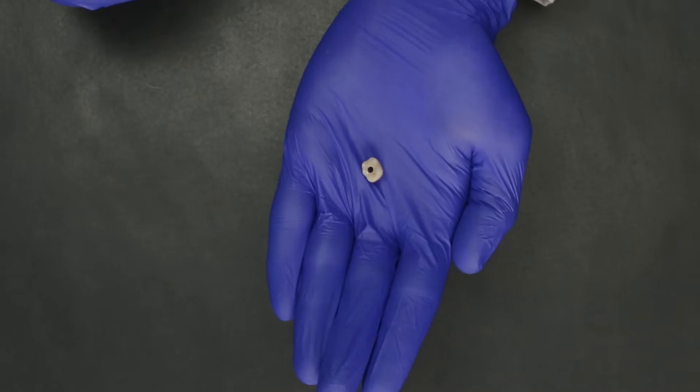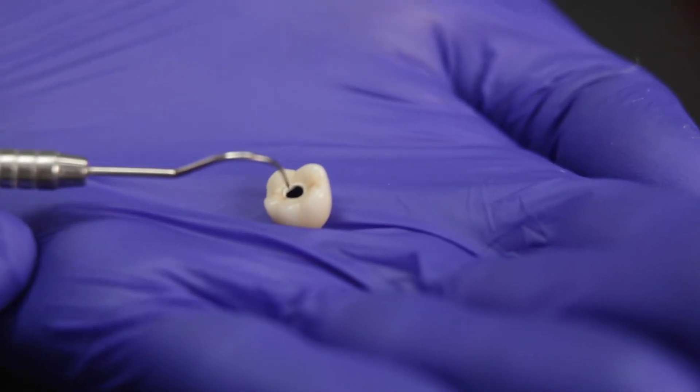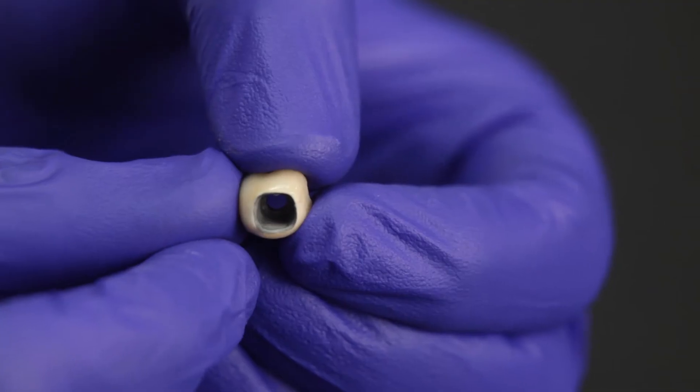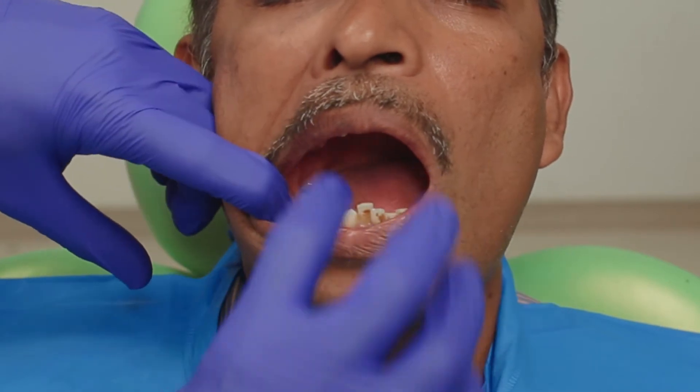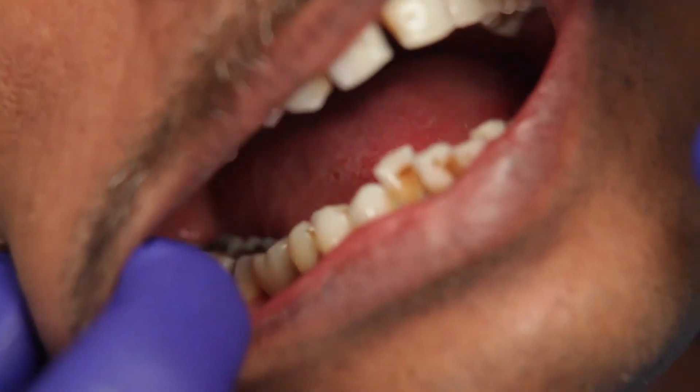I will now go ahead and try-in the crown. This here is a cement retained PFM. I also have an access hole in the crown so in case I need to get the abutment out in the future, I can do it without having to cut through the crown. I will now go ahead and evaluate the fit of my crown. It is very important that the prosthesis should fit passively onto the abutment.